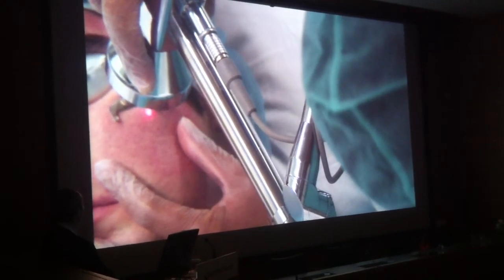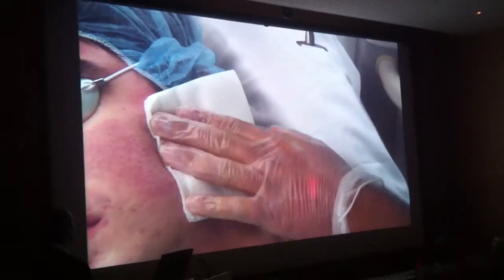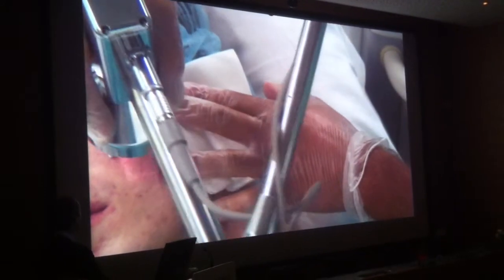Thank you. And as you can see, we have some bleeding here as expected in the fresh lesions, which I have no problem treating, but in the rest of the face where you have no lesions, the coagulation power of the laser is quite good.